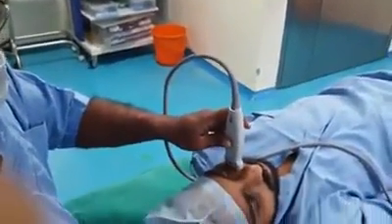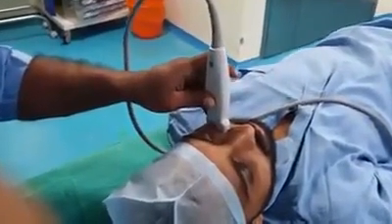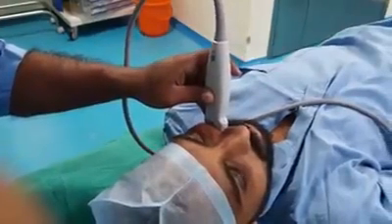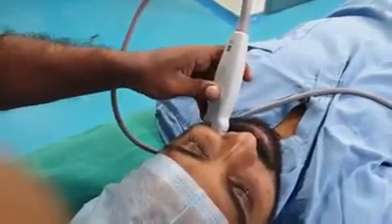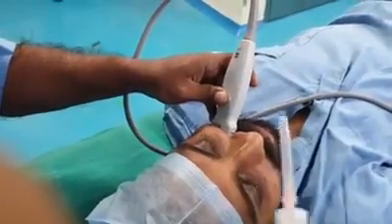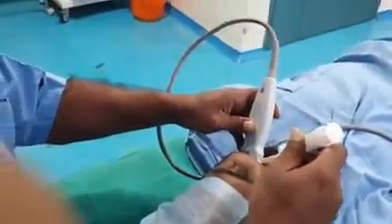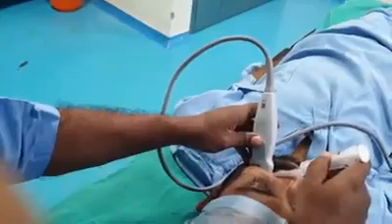So first I will be keeping the probe directly over the zygoma, then slowly I will be taking it inferiorly, then I will be angulating it cranially, until I can see the maxilla on the screen. Now my approach will be from the medial side. So the problem will be that it will be a steep angle.